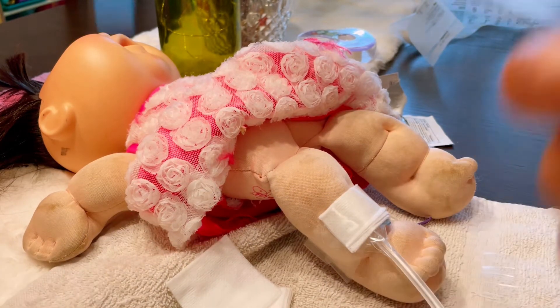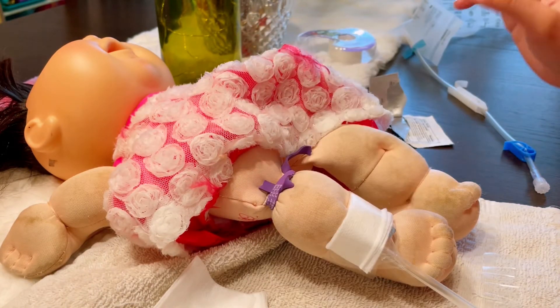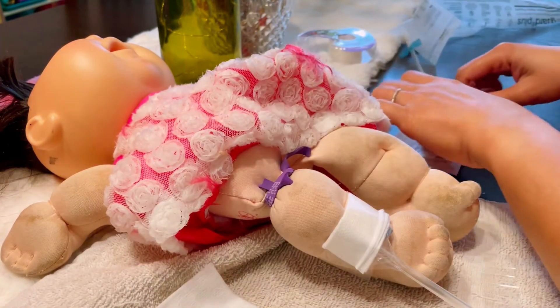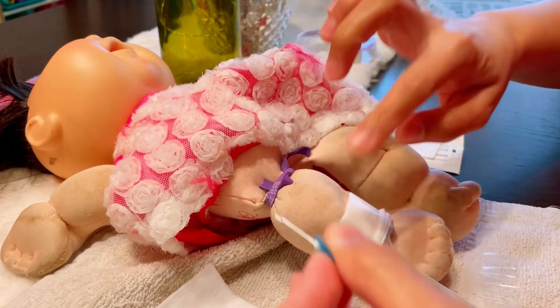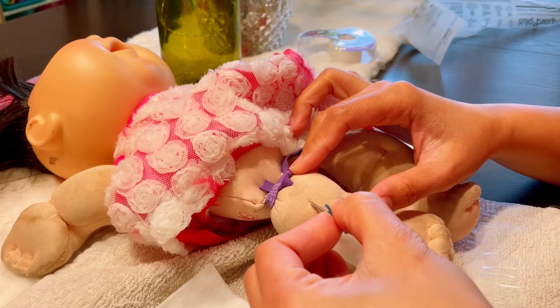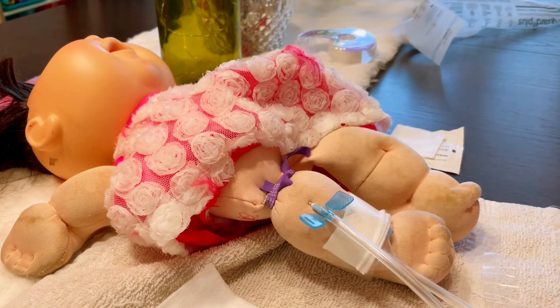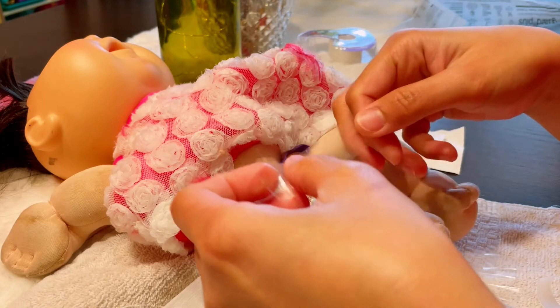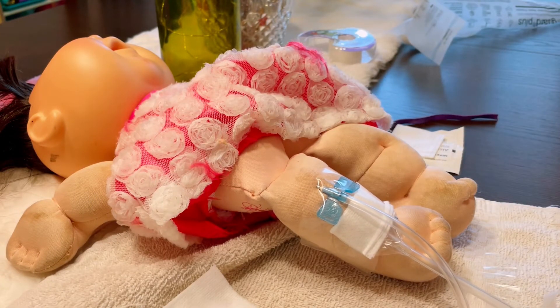Now let's move to the second needle. Apply the tourniquet again, clean the access with a new alcohol swab in a circular motion from inner to outer, then get your venous needle and cannulate. It should be one to two inches apart from your arterial needle so the tip of the arterial needle doesn't sit too close to the venous pressure site. Secure with one tape first, then release the tourniquet.